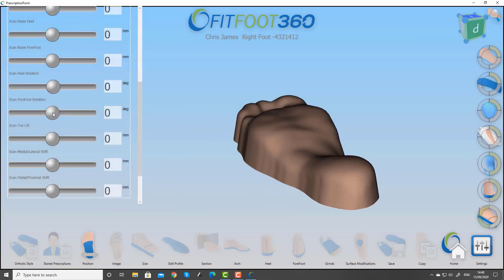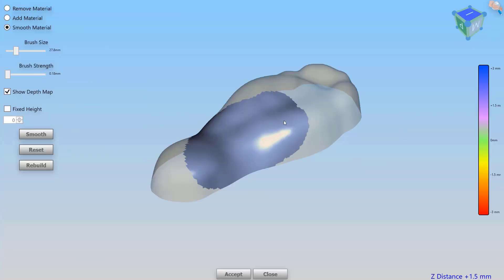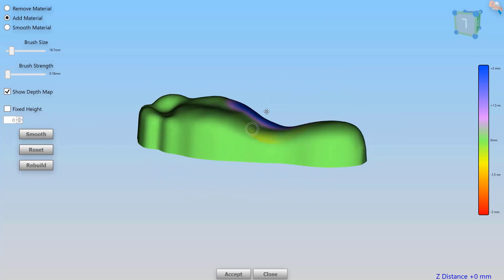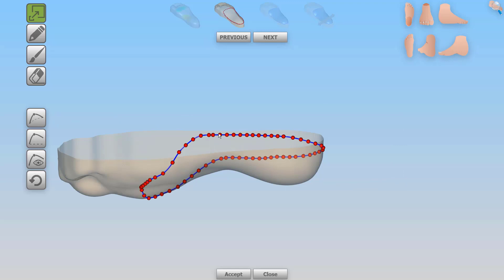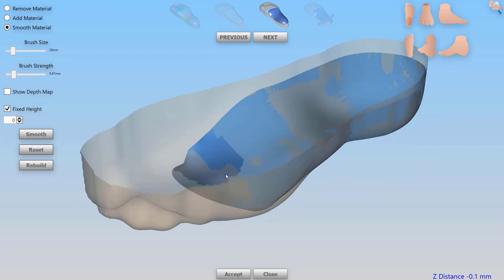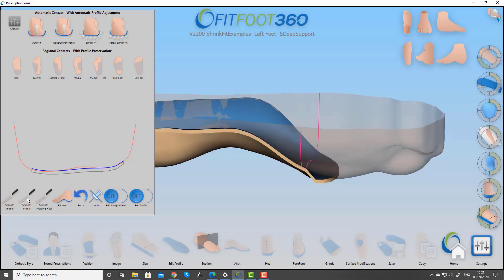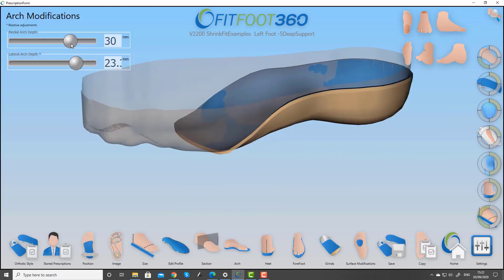We've always had the ability to control the forefoot-rearfoot relationship by morphing the scan, but in version 3 we've added sculpting — the ability to add material, subtract material, and even to control the profile. Here we're looking at being able to fit to the scan, spline areas to smooth through it, and also drop points down to the plane. We can then sculpt that surface to give us the ultimate blend and smooth the profile back in, giving us total control while still being able to manipulate the arch and other features in the device.